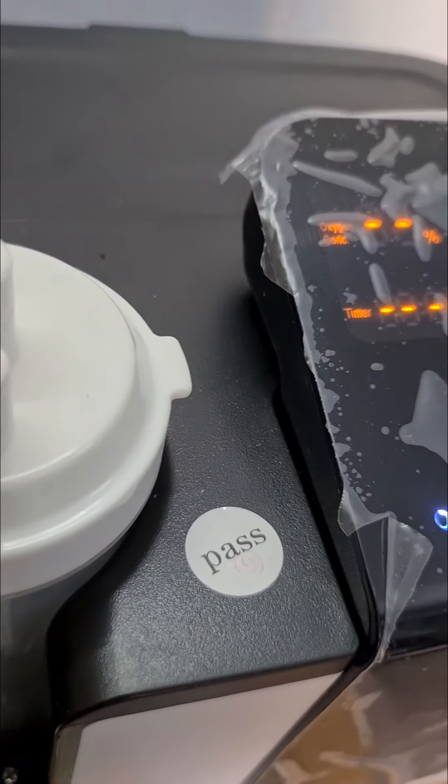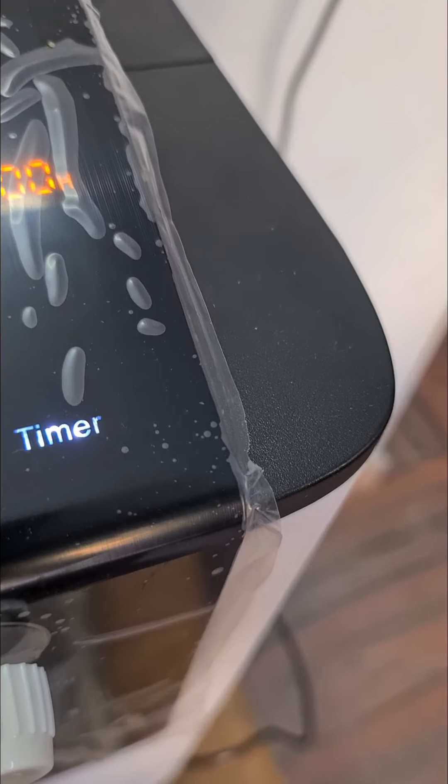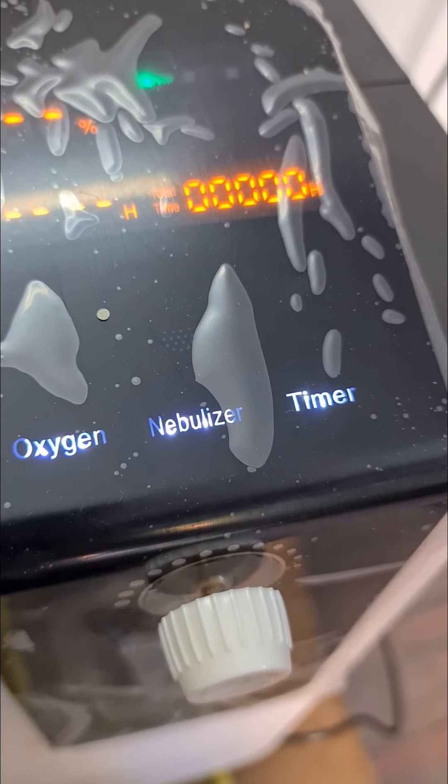The third function is the timer. Generally most of you will not use the timer, but in case you want to, you can set it for 1 hour or 2 hours — whatever you want. After that, the machine will automatically switch off.